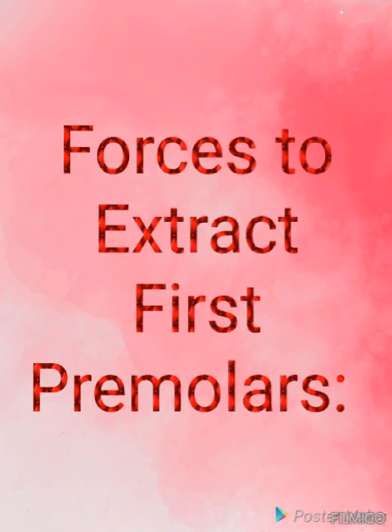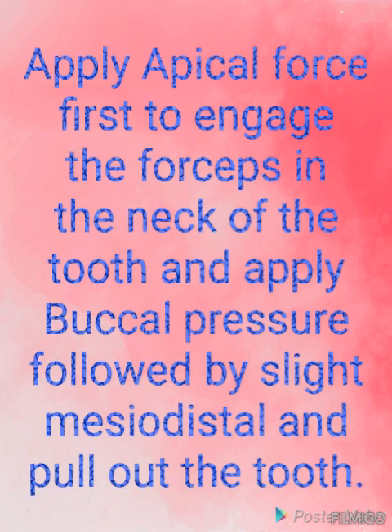Next we are going to see forces to extract first premolars, that is mandibular first premolars. Apply apical force first to engage the forceps in the neck of the tooth and apply buccal pressure, followed by slight mesiodistal movement and pull out the tooth. So buccal pressure, mesiodistal movement and pull out the tooth.